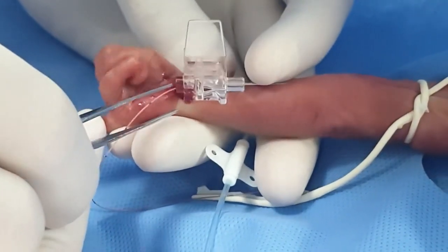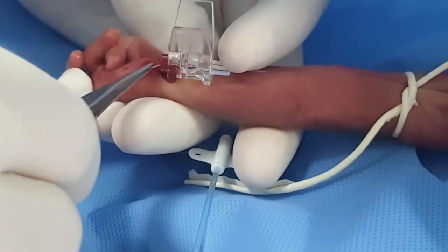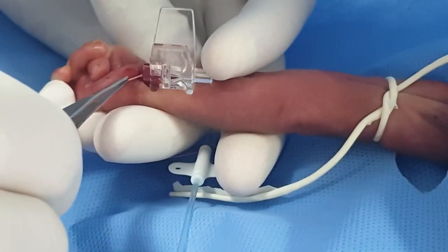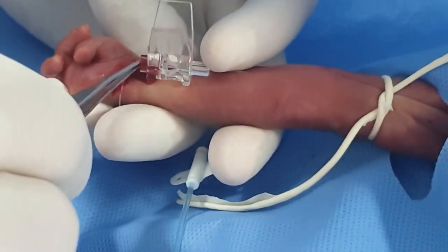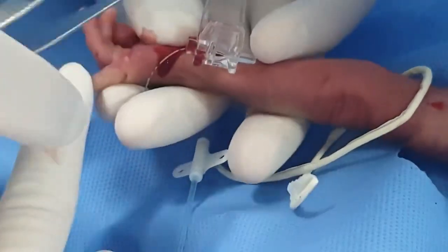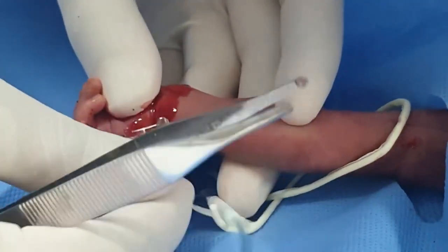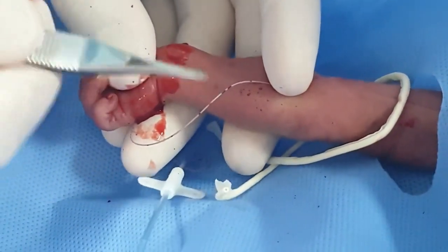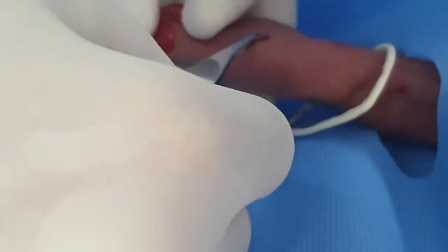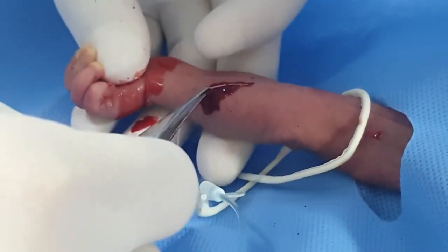As you can see, passing 4 cm means we are in the vein. We are going to introduce until 10, or maybe up to 15, because when we pull the needle out and break the bracket, 5 cm will be retracted from the length. So we are almost at 15 now. We remove the needle and break it, then pull it out. The catheter is out and we are now at 10 cm, so we introduce more to reach the specific length we measured before.